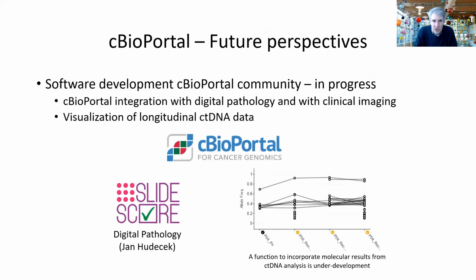So some of the developments that are ongoing at the moment is that there's integration with digital pathology. I mentioned briefly Jan Hudecek. He is involved by HealthRI and also in our institute as a cBioportal expert, but he also created a tool called SlideScore, which is excellently suited for digital pathology. So he's working together with the cBioportal team in the US to have this additional tab in the cBioportal tool where one can connect to SlideScore as digital pathology.